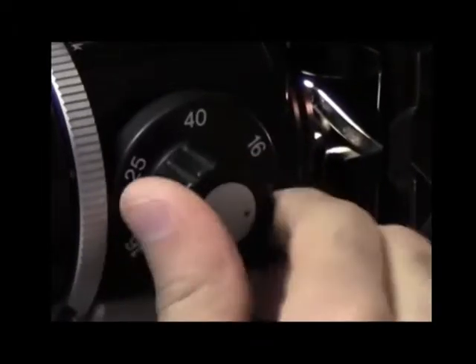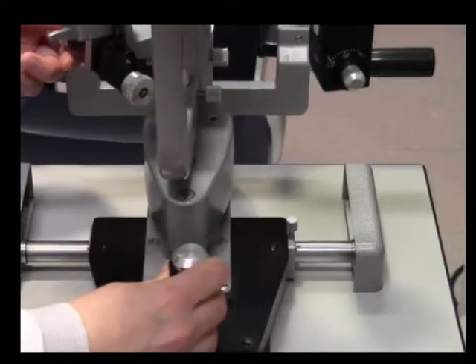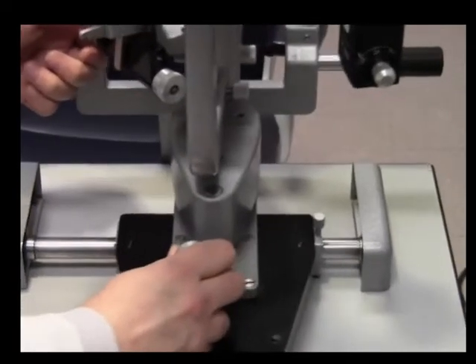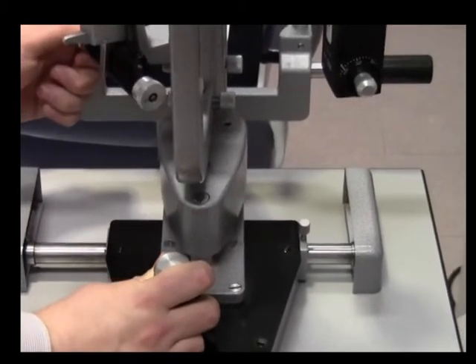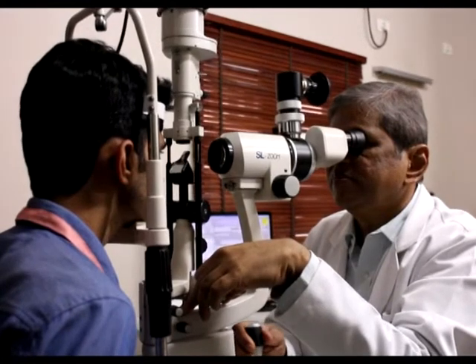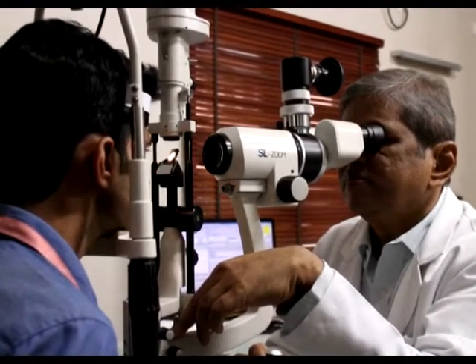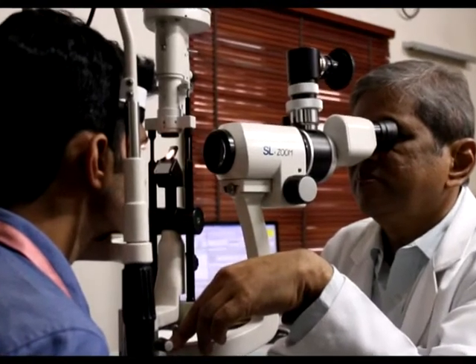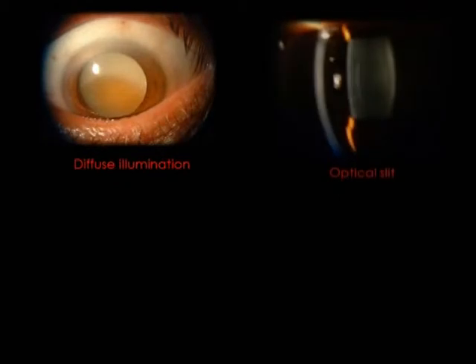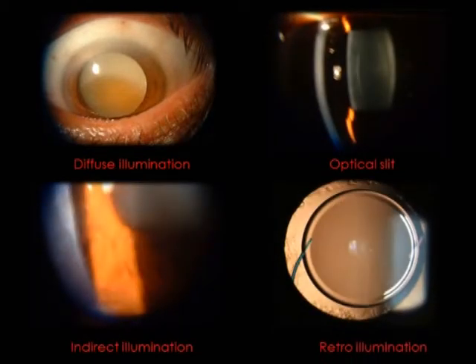The magnification can be changed according to the structure or pathology observed. The joystick allows for smooth horizontal and vertical movement during examination. The light intensity, slit thickness and angulation between the light plane and viewing can be adjusted to create various types of illuminations, few being diffuse direct illumination, optical slit, indirect illumination, retroillumination, etc.